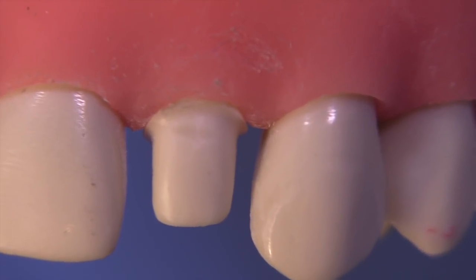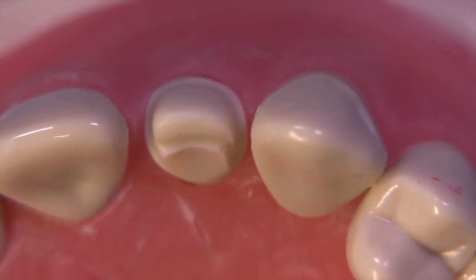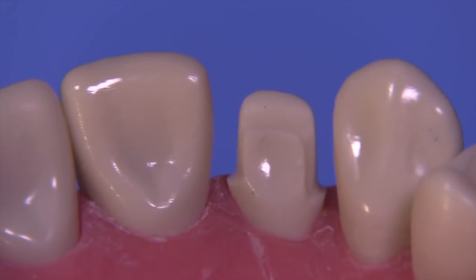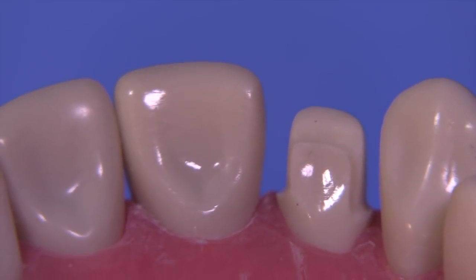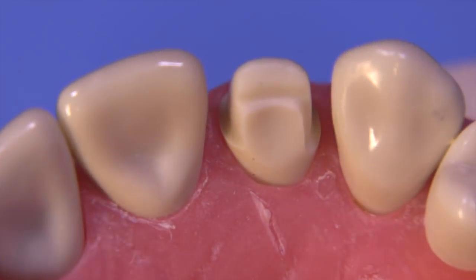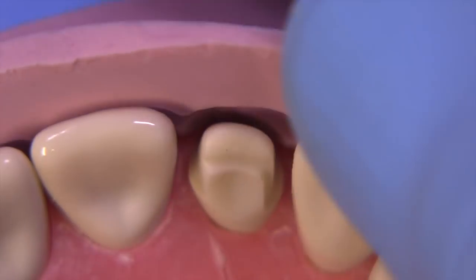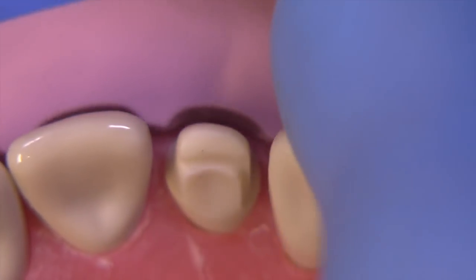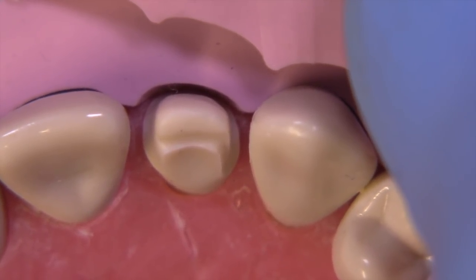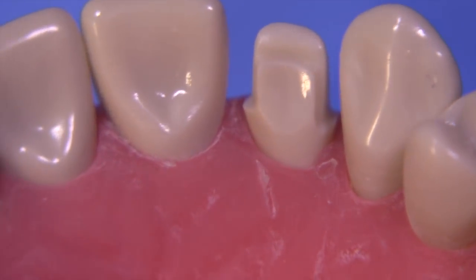The preparation is pretty much finished. It should have no undercuts, should be smooth with a continuous finish line all the way around, and the finish line should be close to a butt joint. We can check our facial reduction — there's plenty of room for the material, and even cutting it back in that incisal area for the addition of feldspathic material.